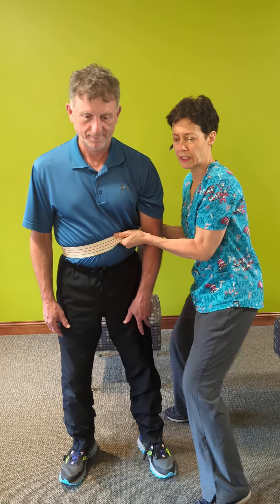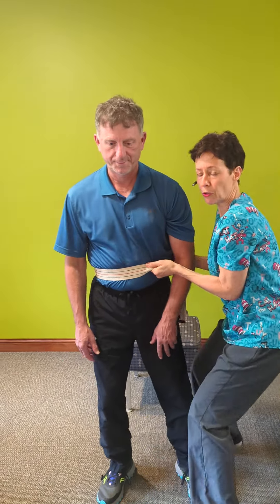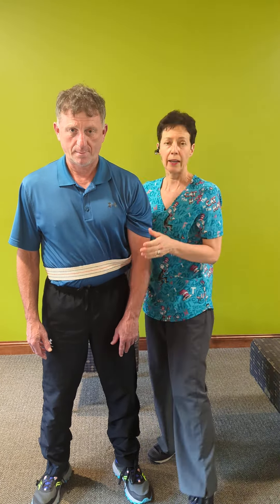If Steve starts feeling faint and he starts dropping, I can hold him even though he's heavier than me, and we're not going to topple over. We're going to slowly get down to the ground together. I encourage all of you who may find yourself in that situation to get one of those little tools.